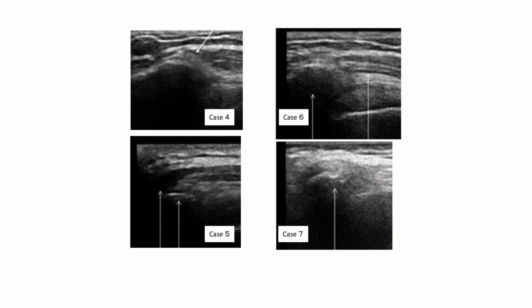I hypothesized that a patient with a shoulder joint injury who had pain extending to the outer central part of the upper arm would be able to confirm the damage by observing the area around the acromion with an ultrasound observation device, and performed echo observation. As a result, damage to the attachment of the deltoid muscle at the acromion was observed.